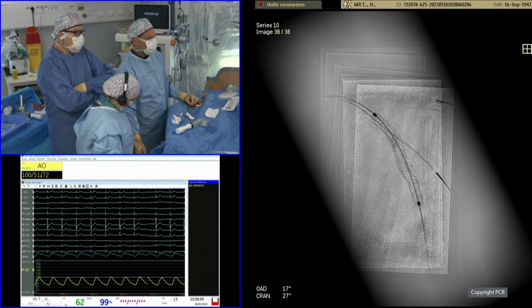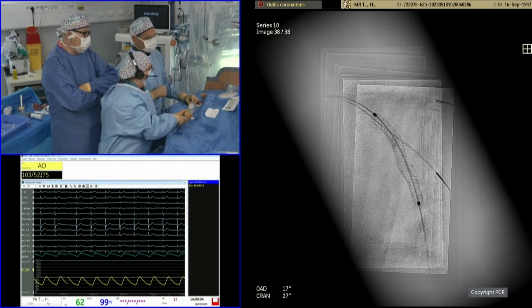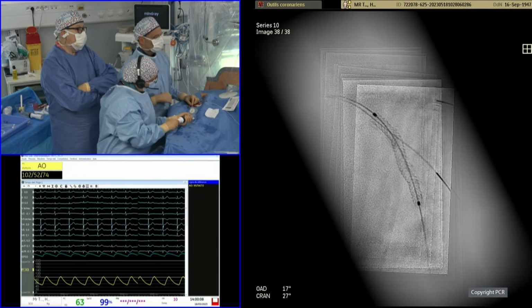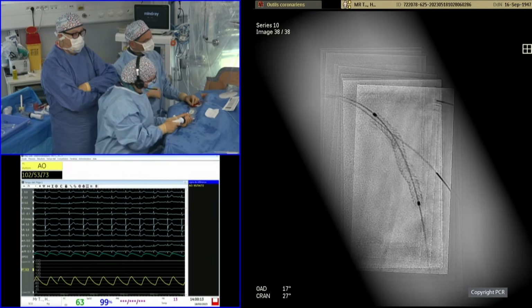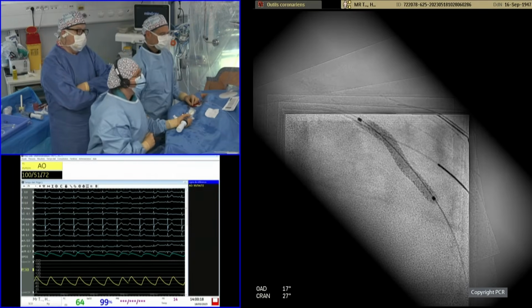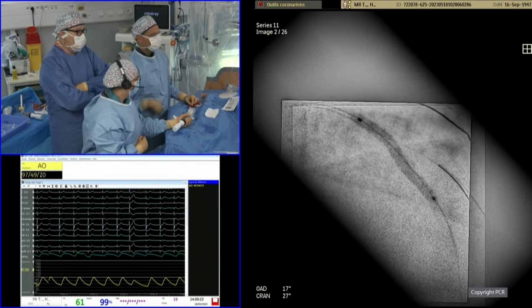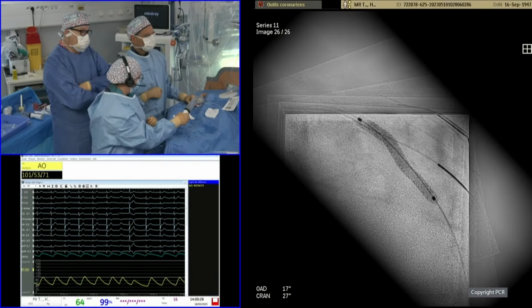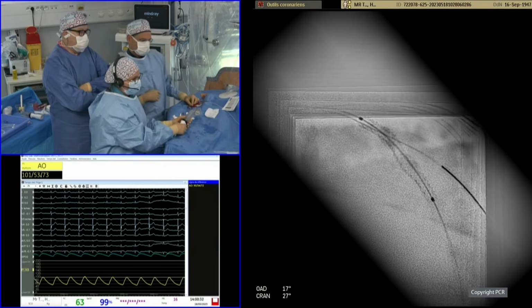But another thing that also is appealing with this case is that we use 2 stents and pay attention to one bifurcation at a time instead of trying to make one size be modulated to fit all. Because then you actually take real care and simplify the procedure for each bifurcation, which is appealing because we want to lower the time for dual and triple antiplatelet therapy. Another limitation of using a very long stent in this situation will be jailing the diagonal wire with a very long stent. Yes. So that's 50 millimeter, another issue.